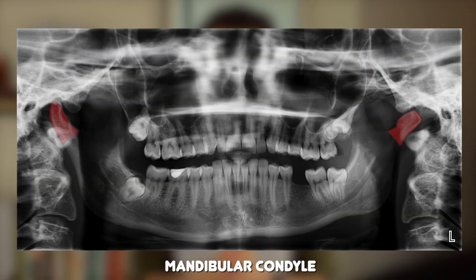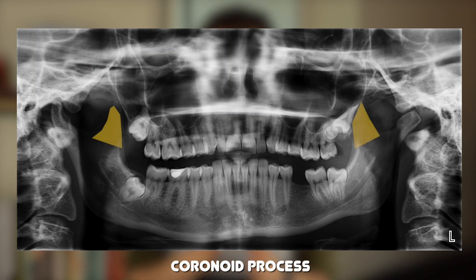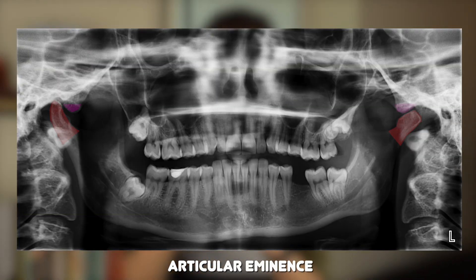Here we can see the mandibular condyle, seen as a rounded radio-opaque area located within the glenoid fossa towards the lateral aspects of the panoramic film. The glenoid fossa is that concave area in the zygomatic process of the temporal bone and it forms part of the temporomandibular joint. The coronoid process can be seen more medial to the condyle as a radio-opaque triangular area, typically overlying the maxillary tuberosity and possibly some of the sinus. Just in front of the condyle and glenoid fossa you can see the articular eminence, which is also a key component of the temporomandibular joint.